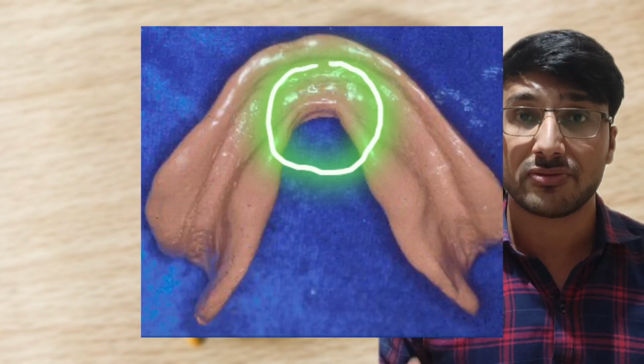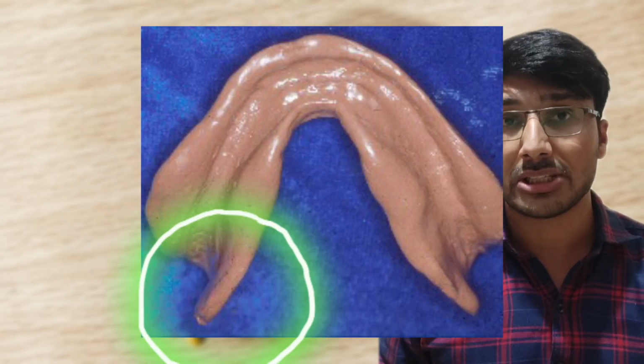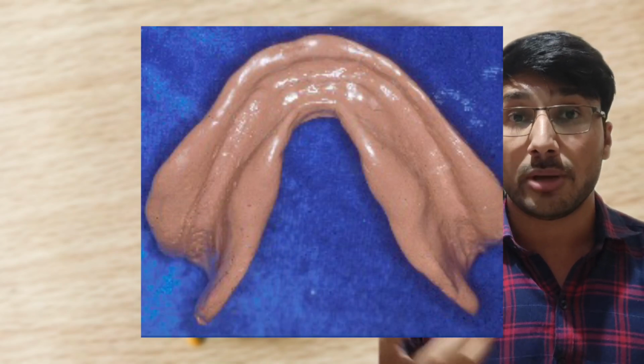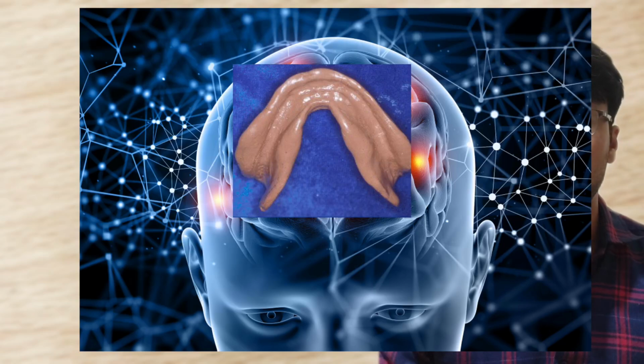You should know what the lingual sulcus will look like, how the alveolingual sulcus will look, how the labial frenum and retromolar pad area will be. Everything you should have in your mind before you take the impression. So how to do that?